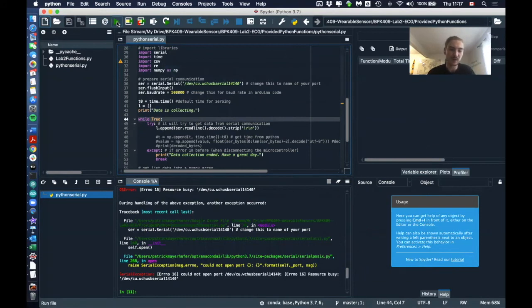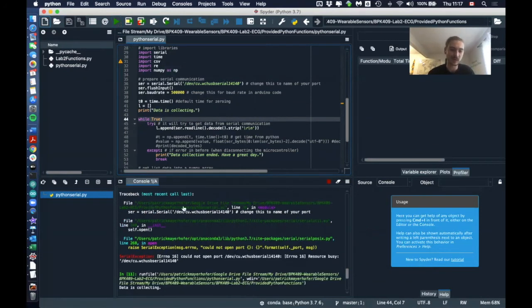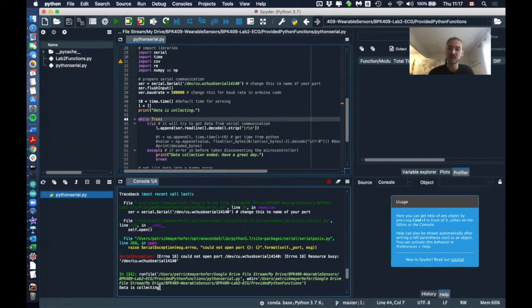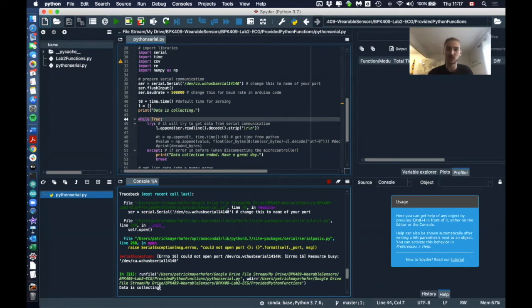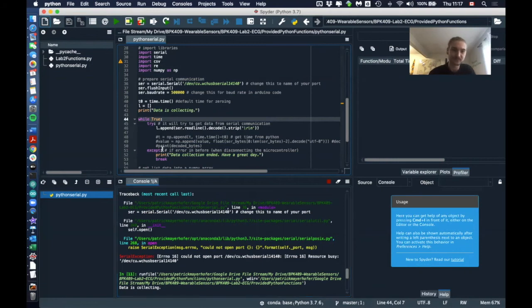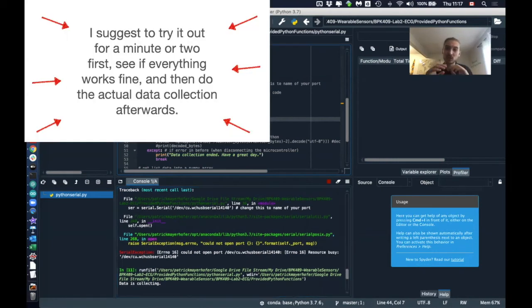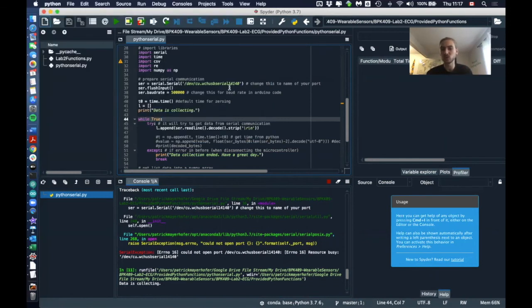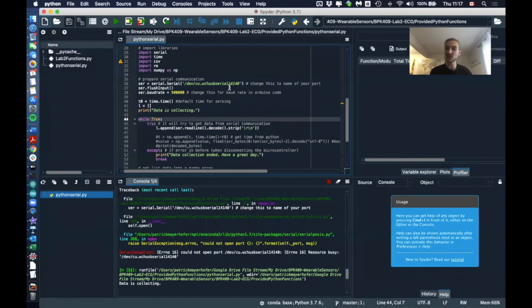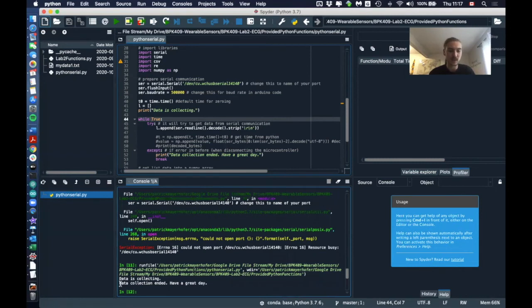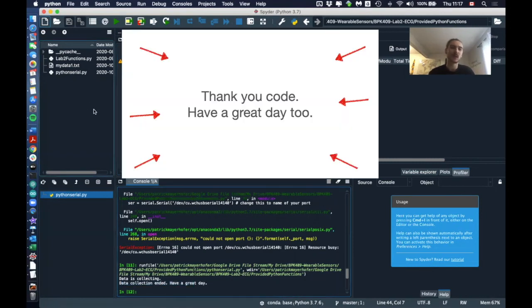And then if we start the collection here, it will say data is collecting. So at this point you can then lie down and just chill and collect your data. So as long as it's saying data is collecting, it will collect your ECG data as long as you want. So if you want to stop the data collection, you'll do the same with the Arduino software—you just disconnect your microcontroller. So you can see, I'm disconnecting my microcontroller now, and then it says data collection's ended, have a great day.